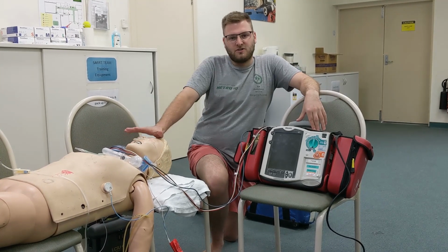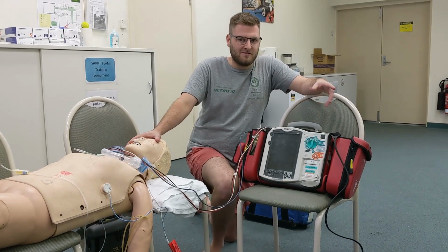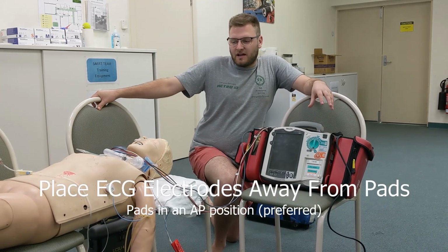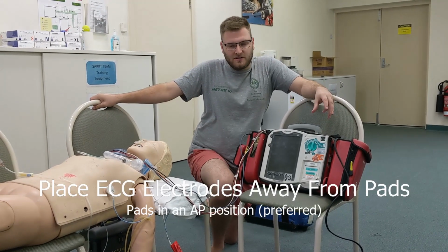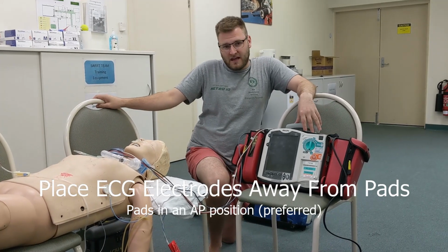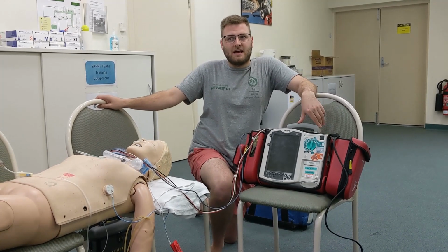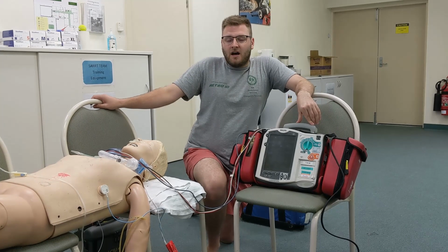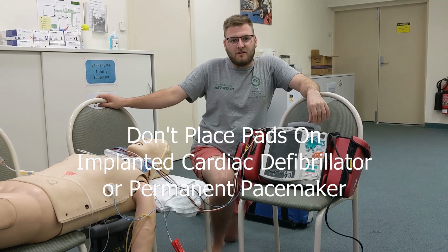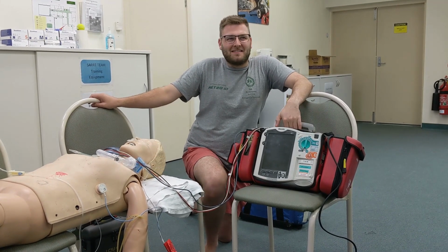Obviously, with procedural sedation, you're going to prepare that airway equipment and have your suction and ventilatory support nearby. So we're going to place the ECG electrodes not near where we're going to need to put the defibrillator pads. Defibrillator pads will need to be placed preferably anteriorly, posteriorly, but can also be placed in an anterolateral position. If they have an ICD in situ, then you should make sure, like I've done in the past, to have the pad not near the defibrillator.